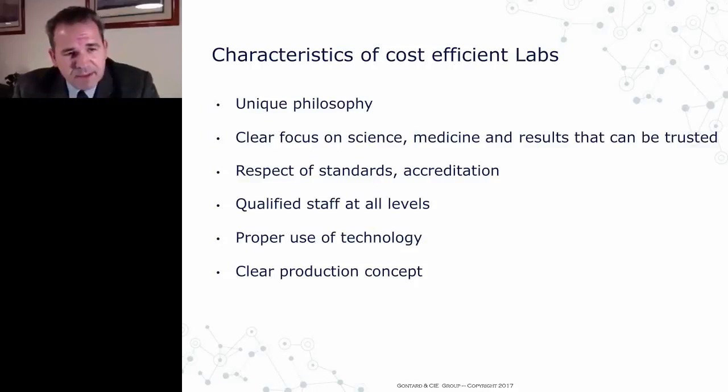To give you a very simple example, in one of the labs we manage, we have multiple production sites with multiple platforms, and one of the platforms requires a systematic aliquot. So guess what? This platform looks cheaper if you look at just the reagent and technology costs, but when you reintegrate the aliquot and the time that is needed and the costs that are linked to performing the aliquot, without talking about the risk of contamination and integrity of the sample, you get a very, very different financial picture than what you look at when you see only the aggregated costs from the accounting department.